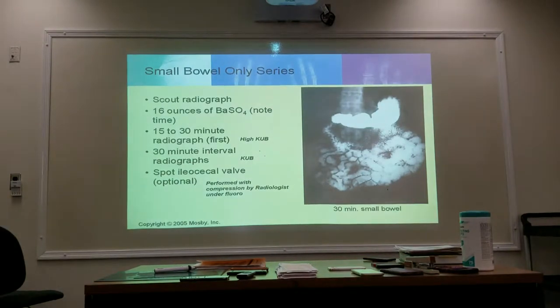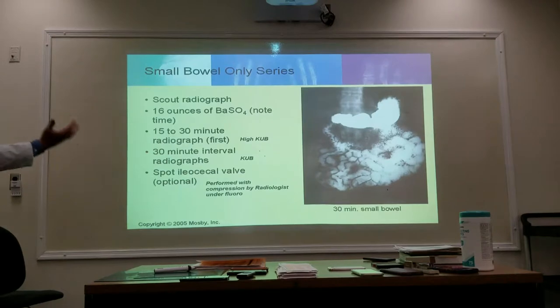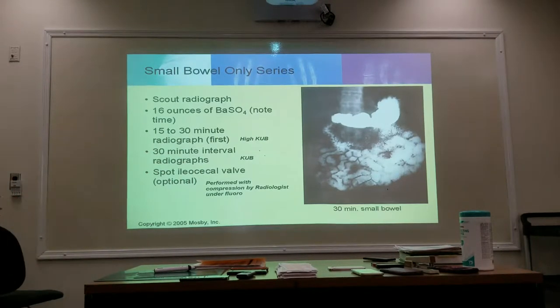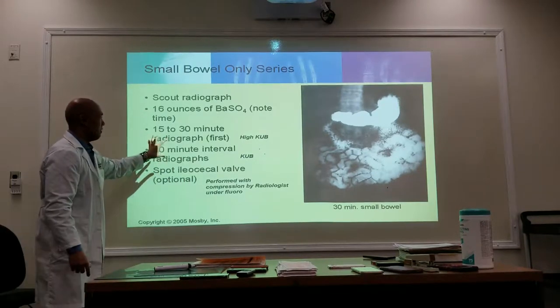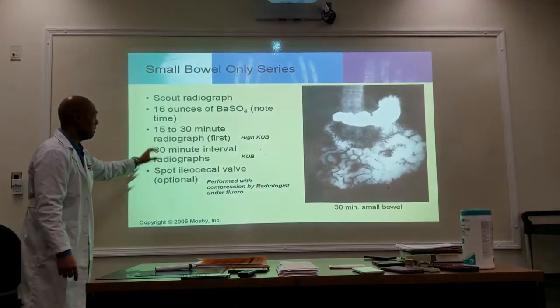All right. So, scout radiograph, 16 ounces, small bowel only series. So, again, take your scout. They're going to be drinking a total of 16 ounces of barium. Note the time. Depending on your protocol, take images at 15-minute increments or 30-minute increments.